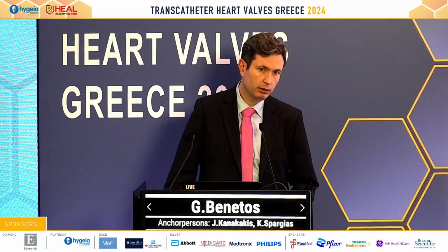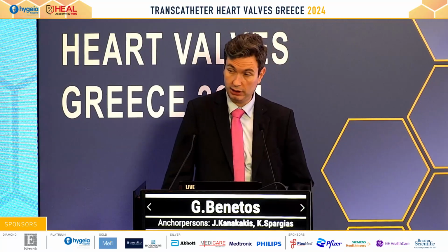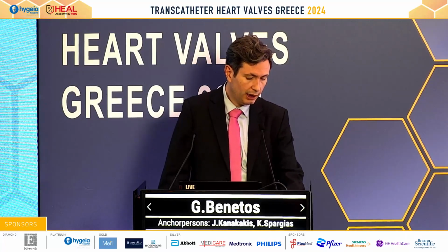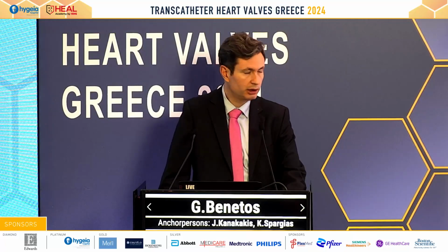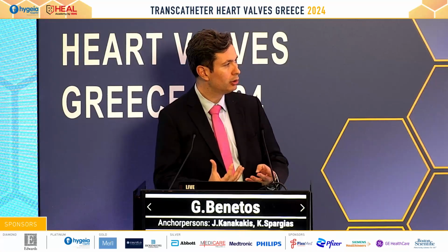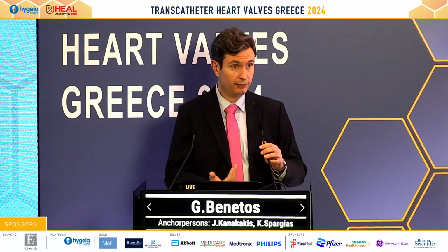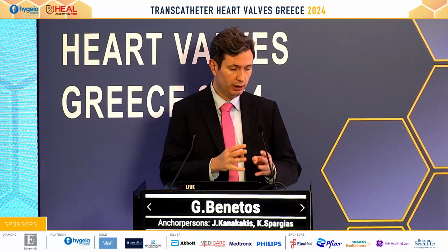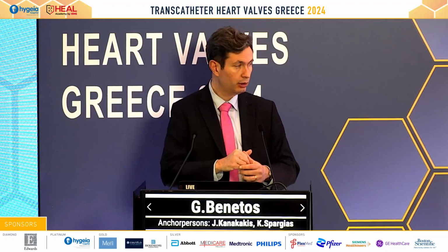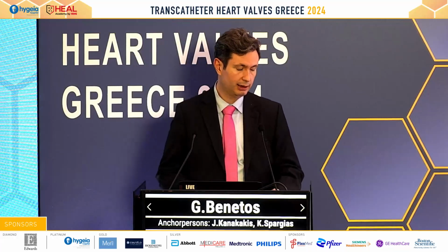I wouldn't depend on the CT. If we are sure from the echo that the aortic stenosis is severe, then I wouldn't deny an operation to a patient according to CT measurements. Sometimes we do a planimetry on CT and the stenosis doesn't seem so severe, but the echo report says it is severe. That most of the times has to do with the fact that in CT you measure anatomical structures, but in echocardiography you also perform functional studies. So it's different.